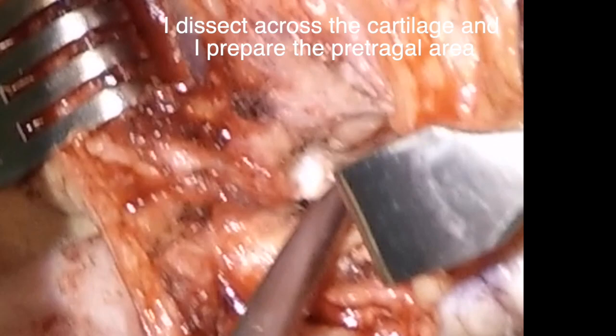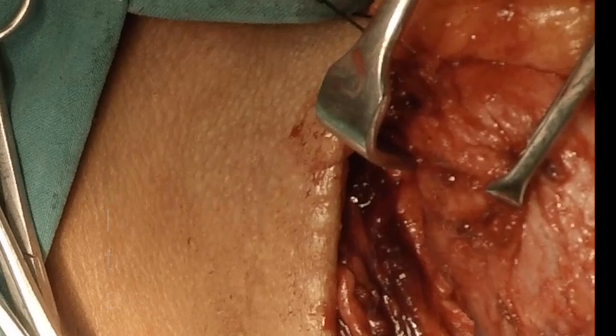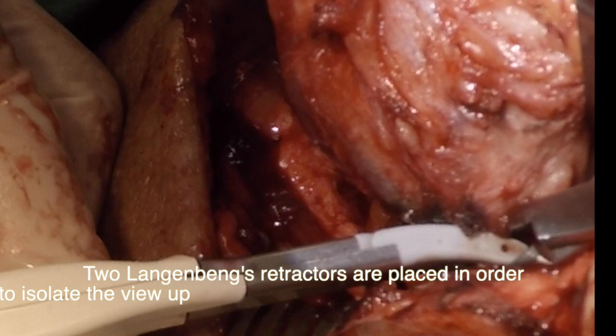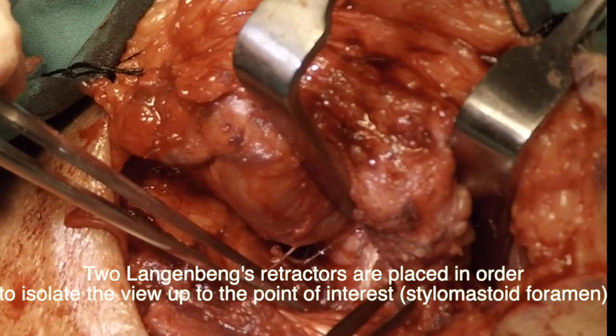I dissect across the cartilage and I prepare the pretragal area. I cut this island of connective tissue safely because it is far above the level of the facial nerve. Two Langenbeck retractors are placed in order to isolate the view to the point of interest at the stylomastoid foramen.